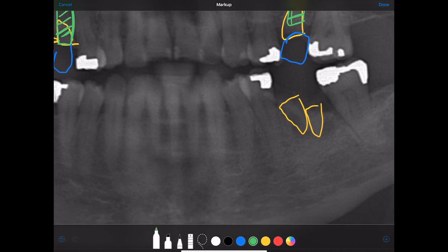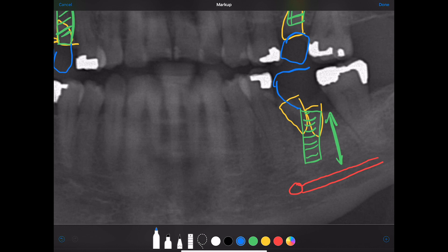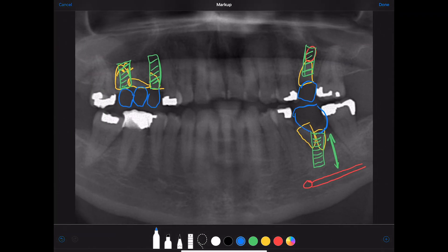Now I'm looking for the inferior alveolar nerve — we've got it right here, here's the little foramen. It looks like we definitely have room to place our implant. It looks like more than 10 millimeters, so I'll place a 10 millimeter implant. We have enough space here, though it'll be kind of a wider crown.